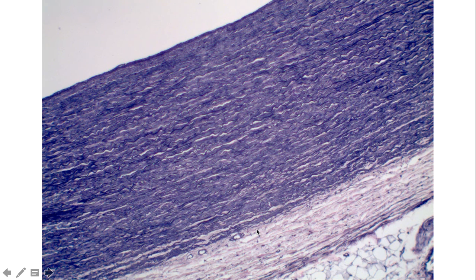And in our aorta slide, we're also going to be able to find these small vessels that help nourish the actual walls of this aorta. Again, these are referred to as the vasa vasorum, or the vessels of the vessel. And so hopefully that helps with these few slides we have related to blood vessels.